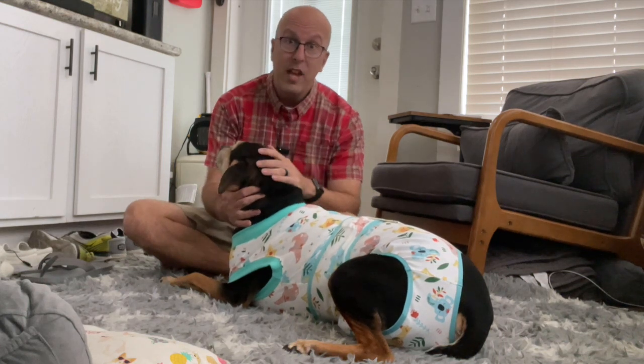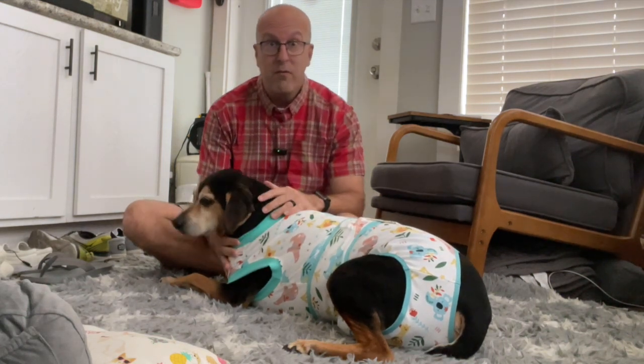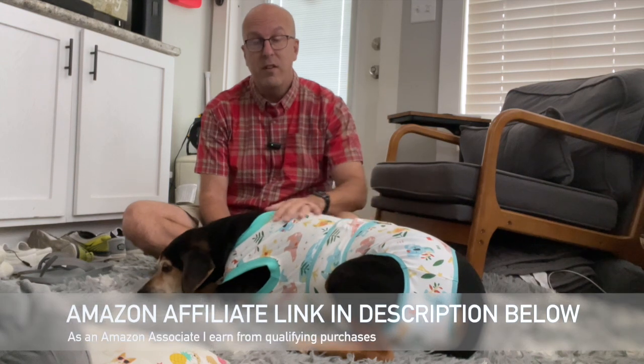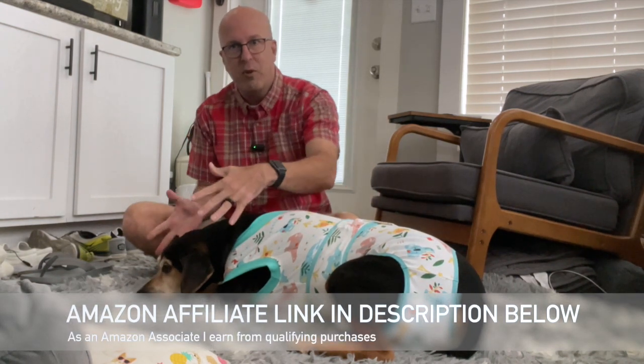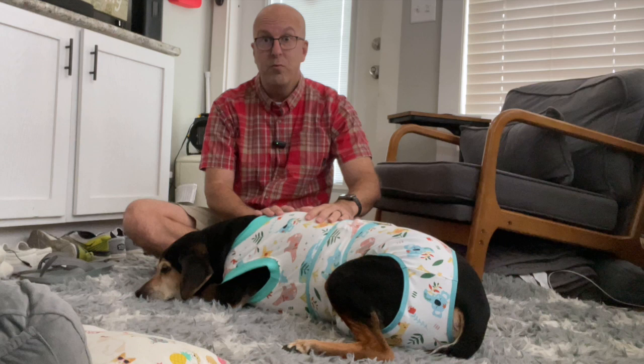Hey everyone, welcome back to The Campground, and today we're going to take a look at the Kusar Pet Recovery Suit. This is great for dogs that have gotten neutered or spayed or are having surgery anytime soon. Instead of having the cone of shame around them, you can have this body suit that covers them completely from head to tail and prevents them from licking and damaging the wounds.